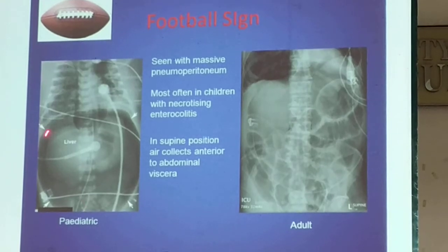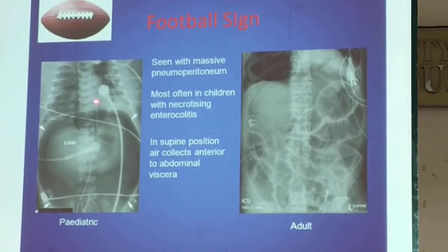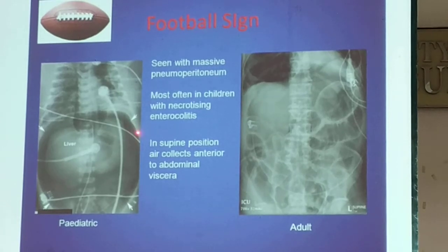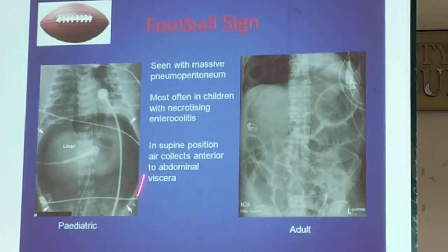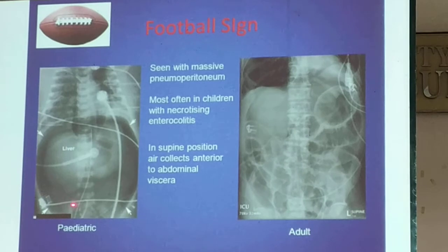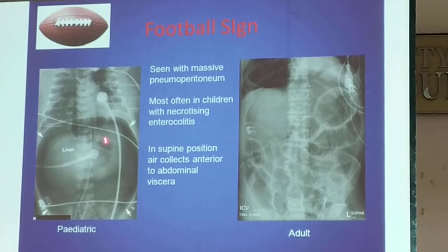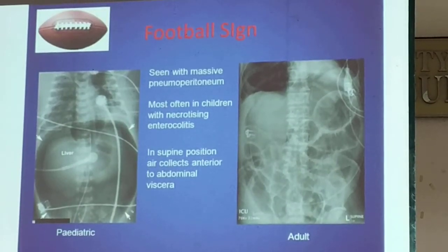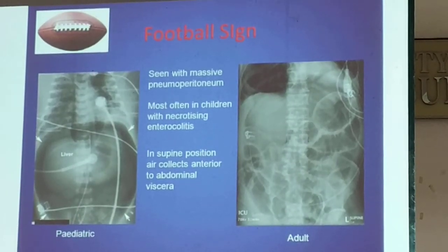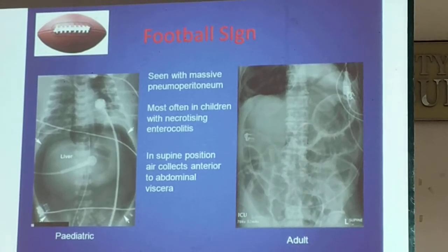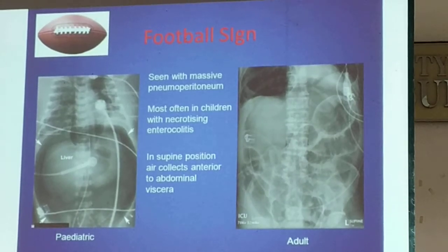There is generalized air within the abdomen — it looks like a football. This is what you call the football sign of pneumoperitoneum.